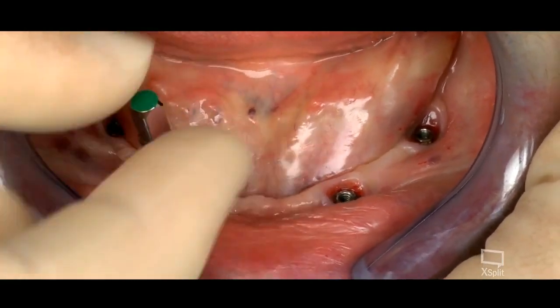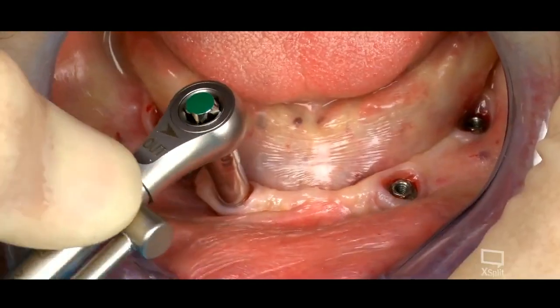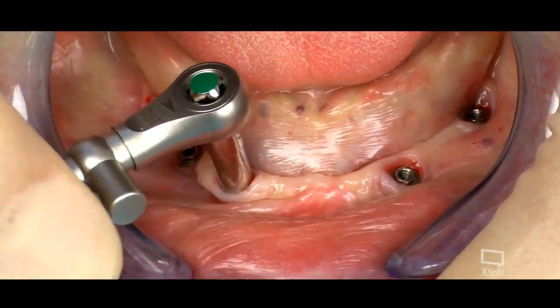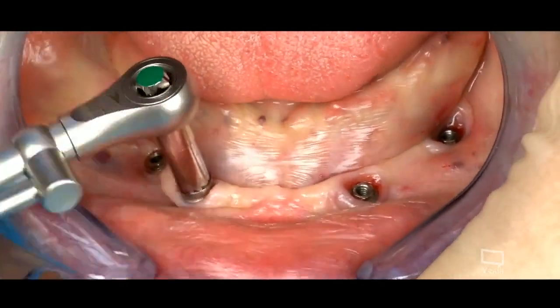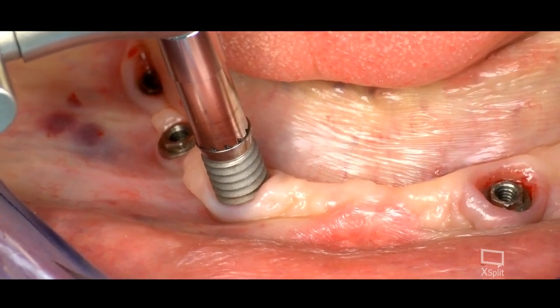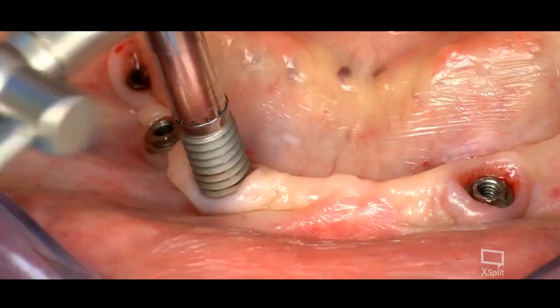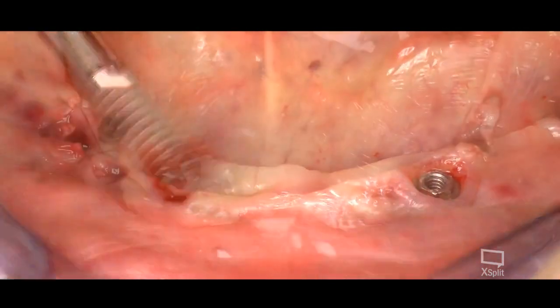It was not integrated accurately, and that's one of the reasons why he decided to remove it and replace it in a better position. And as I told you before, you have no connection. The implant is coming out really, really easy. You have basically no connection with the bone. It's really clear, the implant.